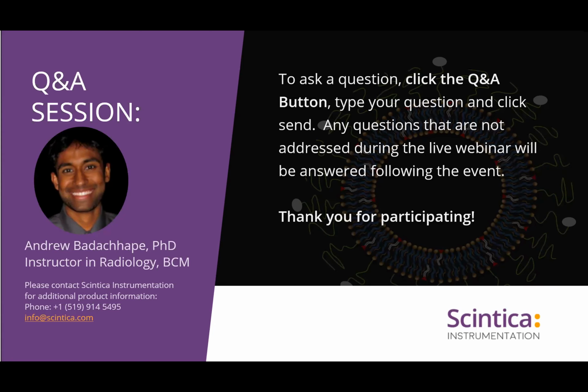And then same questioner, what is the liposomal half-life in tissue? Can you use it for steady state venous imaging? We can use it for steady state venous imaging. I don't have the half-life in tissue off the top of my head. I think it would probably depend on the fractional blood volume for the tissue at hand. For instance, in the placenta or the tumors, it's going to have probably a half-life closer to that 18-hour mark. Again, I'm going to refer to the Eric Tanfum paper, which looks at liposomal gadolinium half-life in various tissue, and I'm going to recommend looking at that.